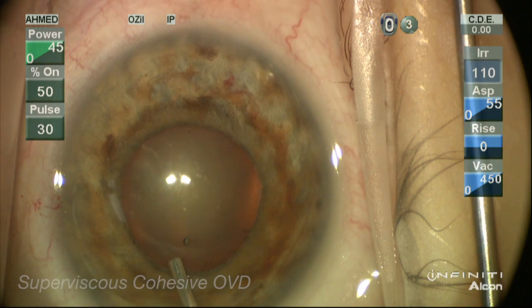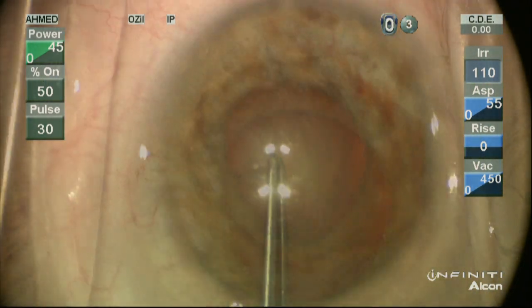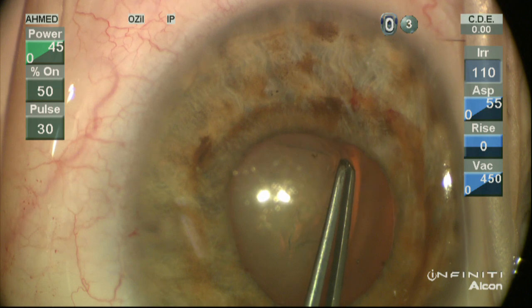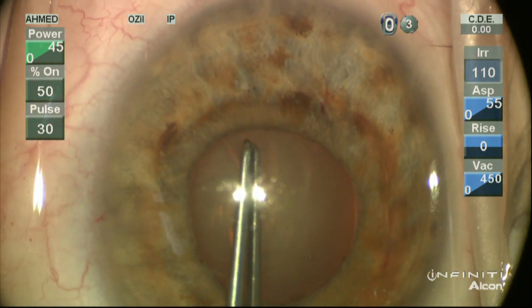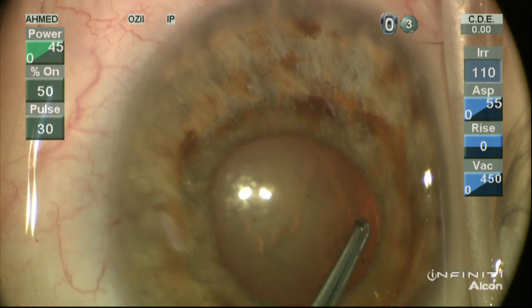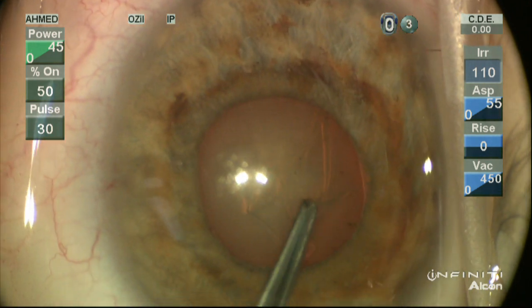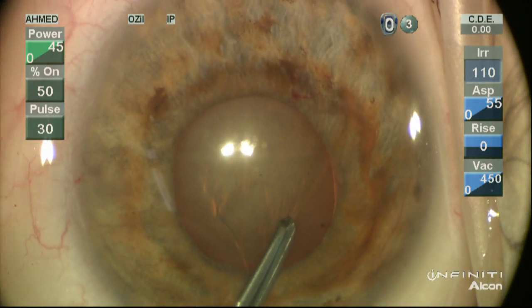In this case, you can see the gentle injection at the pupil margin — pushing the iris away is the effect of the Helon 5. The capsular rhexis is being performed here, and after initiation we let the rhexis run slightly under the iris beyond the pupil edge if necessary to ensure we get a good 5.5mm capsulorrhexis.